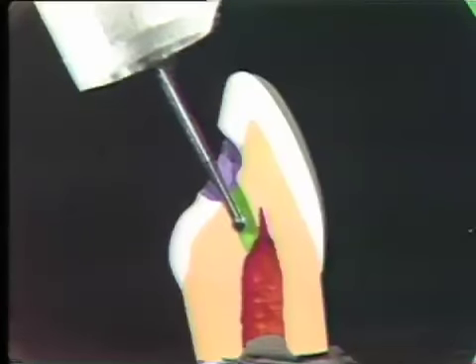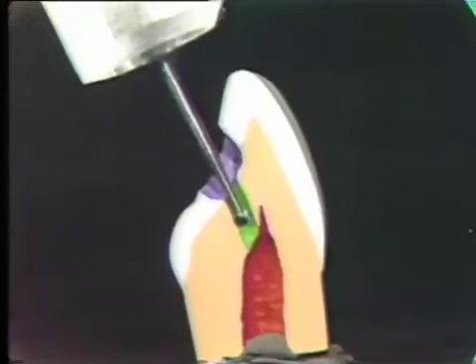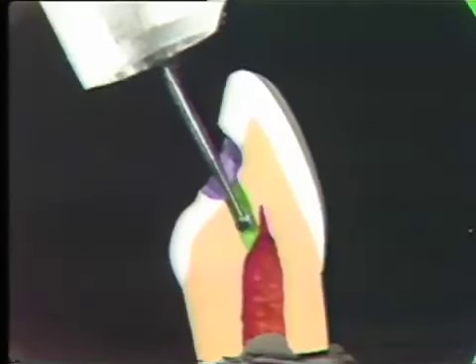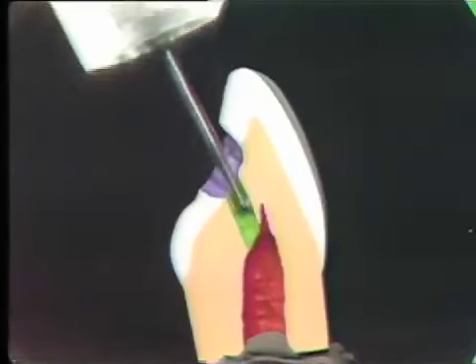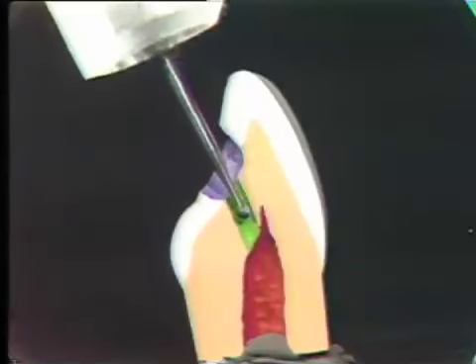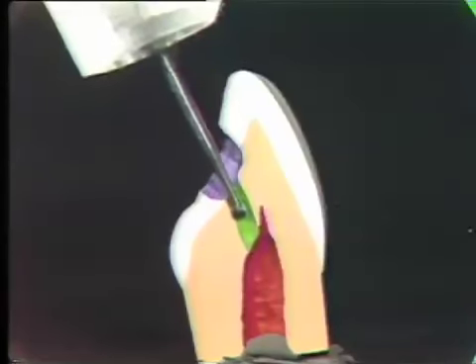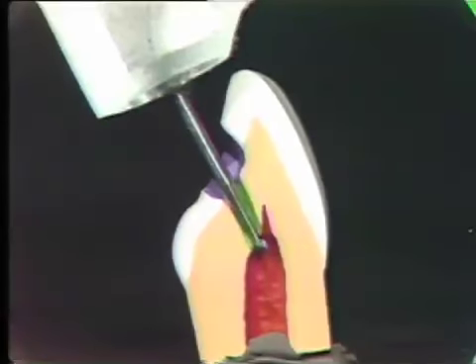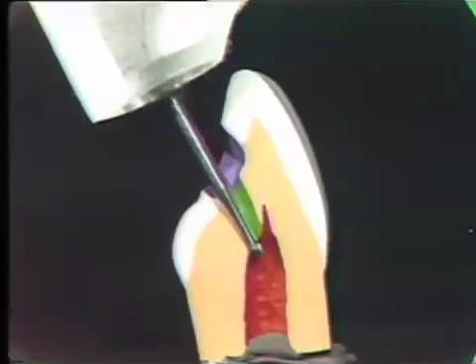The second way you might get into trouble is if you're in the proper angulation and you get part of the way to the pulp and you get kind of nervous and you feel like you've gone too far, so there's a tendency to start to drill around in this area looking for the pulp. You never want to do this because if you find the pulp, it'll just be by accident. The only way to find the pulp is to really know where it is and go directly to it. Once again, you'll feel the burr fall into the pulp chamber as there's a sudden reduction in drilling pressure as you enter the pulp.